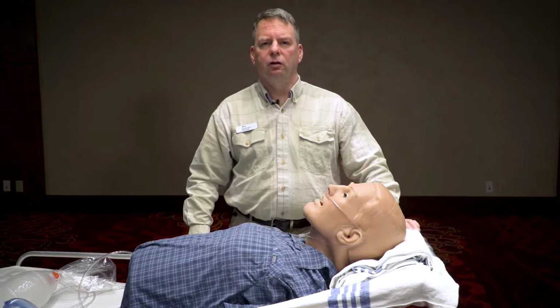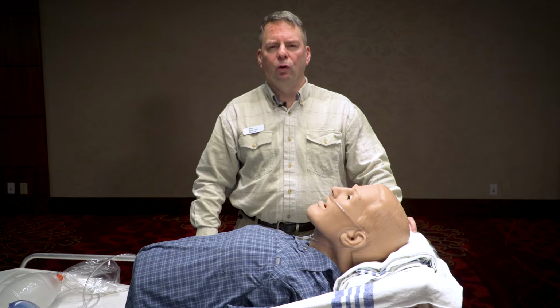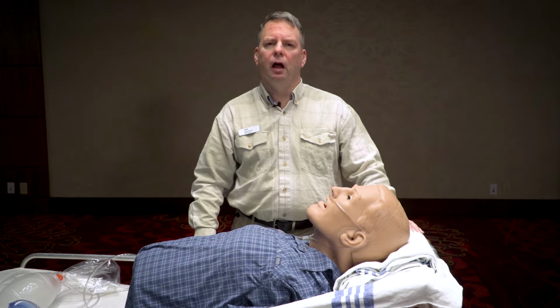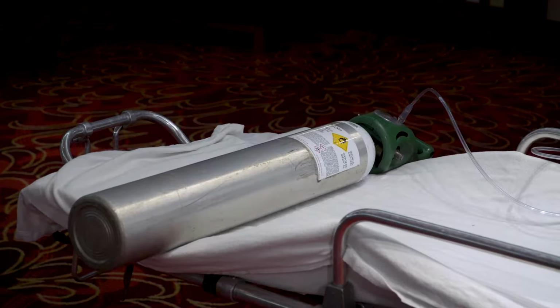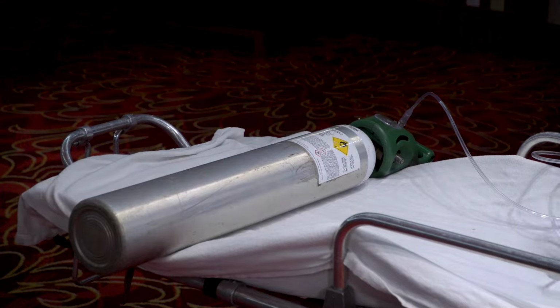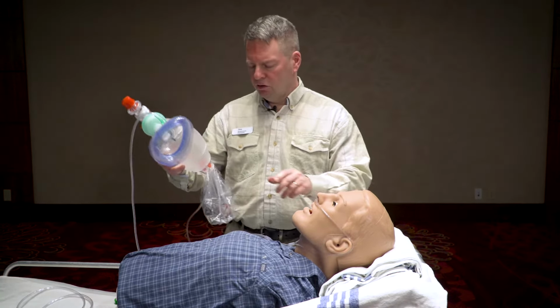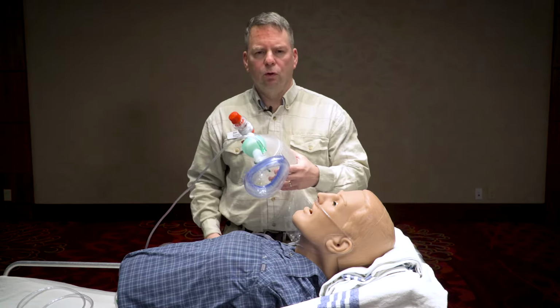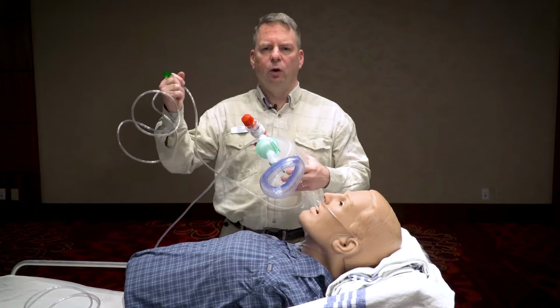I just want to do a quick demonstration of what's called external CPAP. So I've done a video already on high flow nasal cannula, and the idea would be if you only had one gas source, you would need a bag valve mask, and the patient, you would leave them on their nasal cannula. So normally to do bag valve mask ventilation, you would connect the bag itself to oxygen flow.